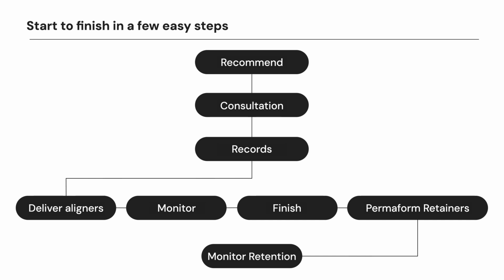We're going to come back here now, go back to the middle, because we're going to monitor that retention. How long? Rest of their life. We want to make sure that we keep those teeth in the beautiful position that they're in so they don't move and we end up with something that looks really nice.